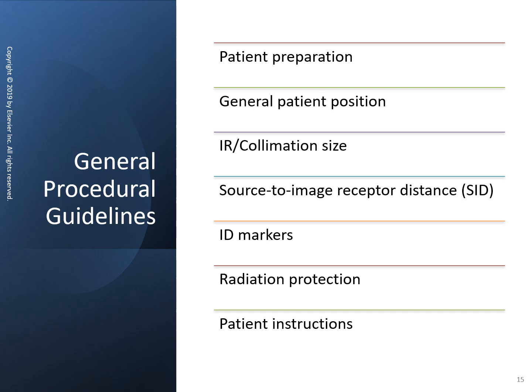We're going to look for piercings. We're going to look for necklaces. We're going to ask about those things. If the patient is wearing a shirt with buttons, either at the collar or down the front, or a zipper in the back, those have to be removed. For both ribs and sternum, bras will produce several artifacts, the hooks in the back, the underwire. All of those things will produce artifact overlying pertinent anatomy, and so bras should be removed.